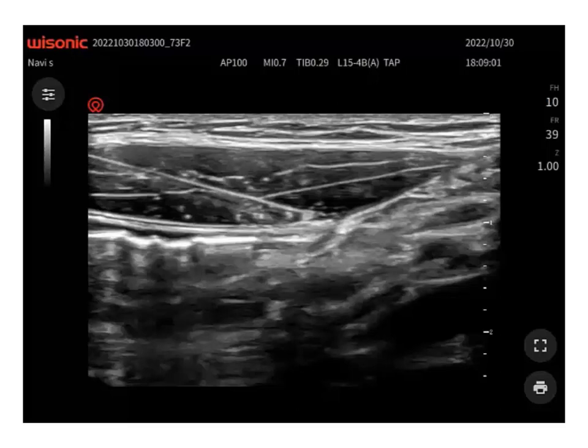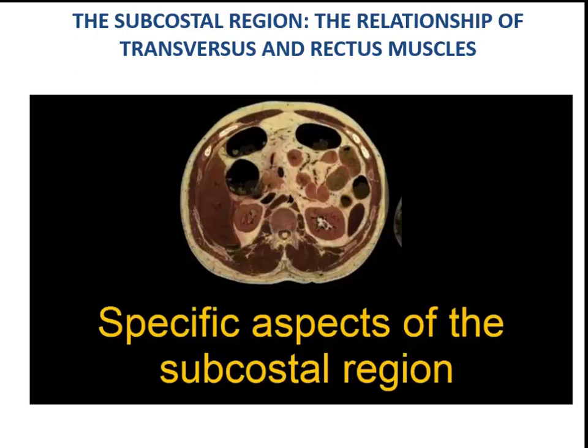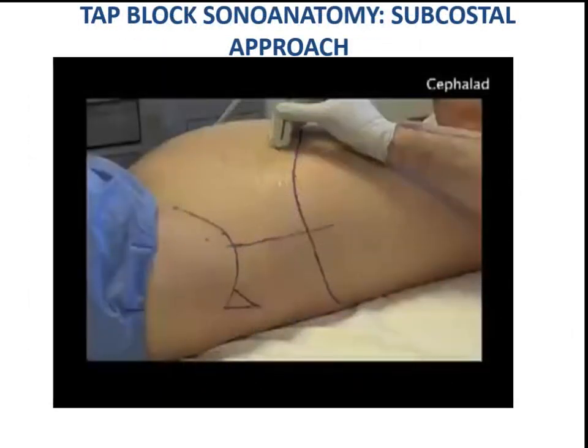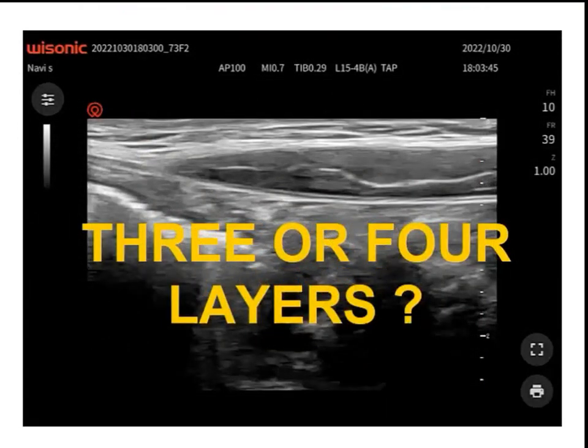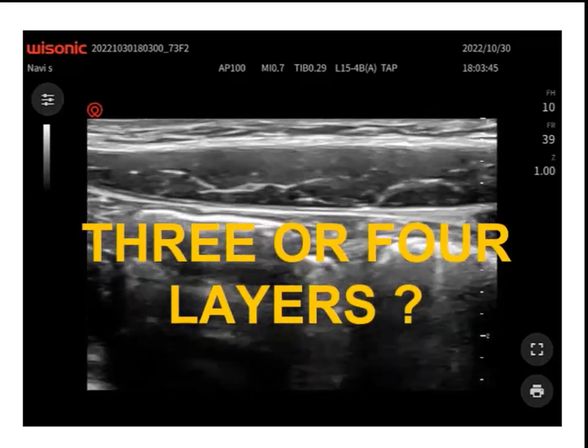In the upper abdomen, exactly in the subcostal region, the transversus abdominis forms its aponeurosis much closer to the midline. In fact, the transversus abdominis muscle underlaps the rectus sheath. In this ultrasound clip, the transducer is translated laterally just below the costal margin. As the scan moves past the lateral edge of the rectus muscle, the external oblique muscle appears superficial to the transversus abdominis muscle. The internal oblique muscle is not yet visible because in this region the muscle has transitioned to its aponeurosis, which is sandwiched between the external oblique and transversus abdominis muscle. As the transducer is moved even further laterally, the internal oblique muscle becomes visible between the external oblique and transversus abdominis muscles.